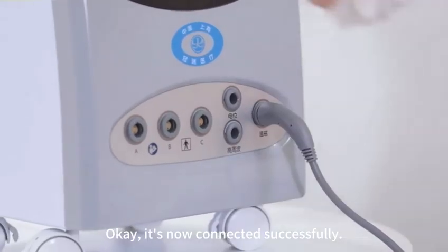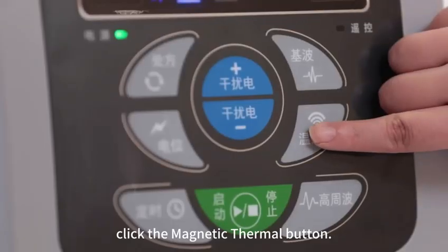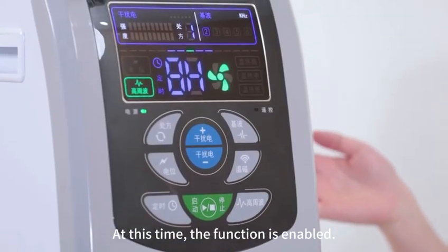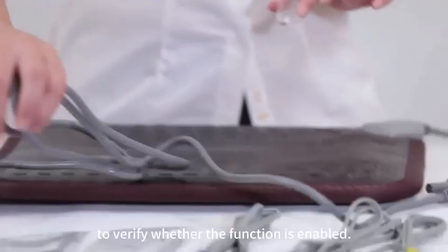Okay, it's now connected successfully. We click the magnetic thermal button on the operation panel. At this time, the function is enabled. We can use a small magnetic bead to verify whether the function is enabled.